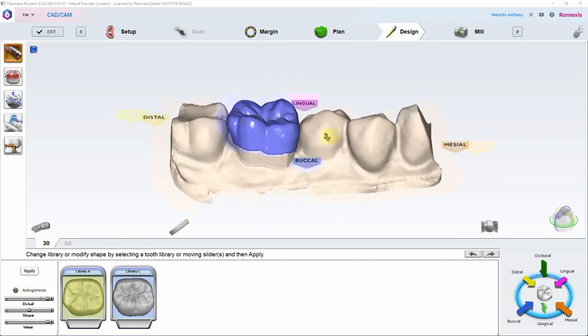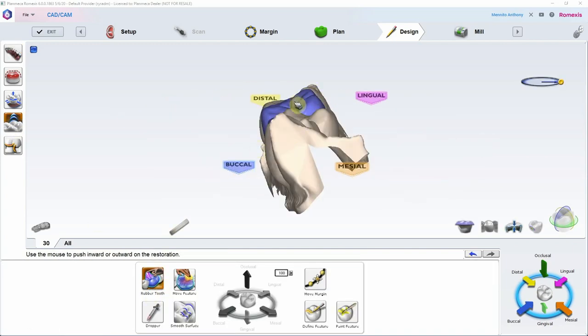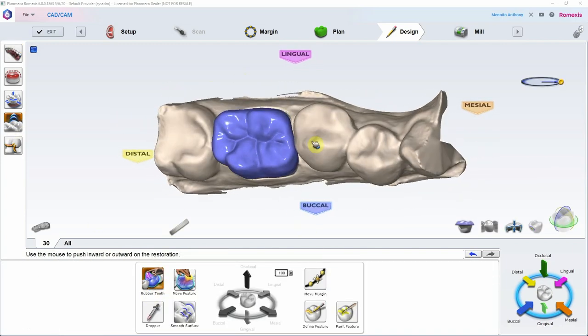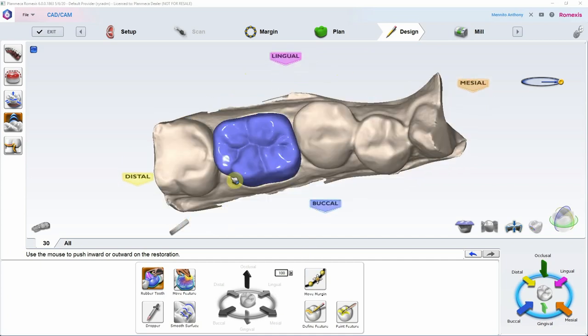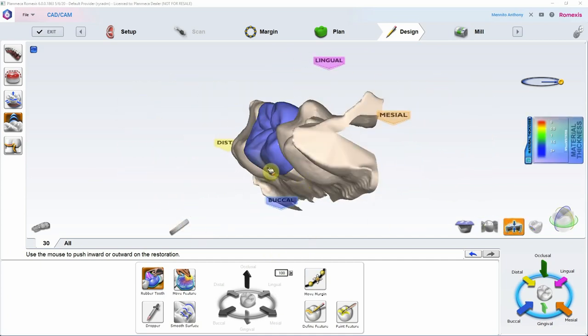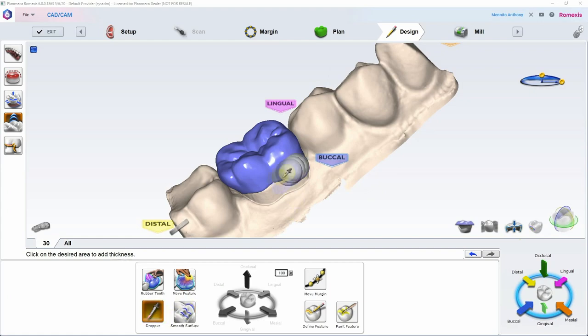The other is that Romexis has a really powerful tool called the pre-op tool that you can use for, say, designing on a single central, or if you have a tooth that you're repairing that is an abutment for a partial denture, and you want to save that anatomy from where the clasps engage or a guide plane or something like that.